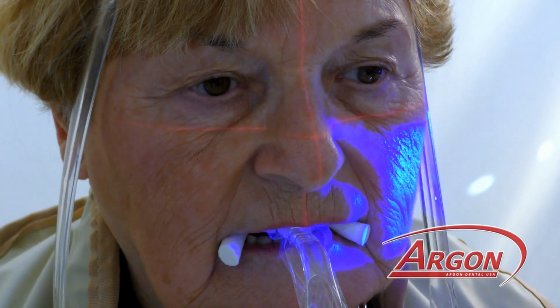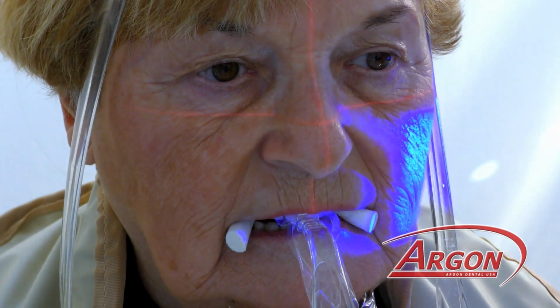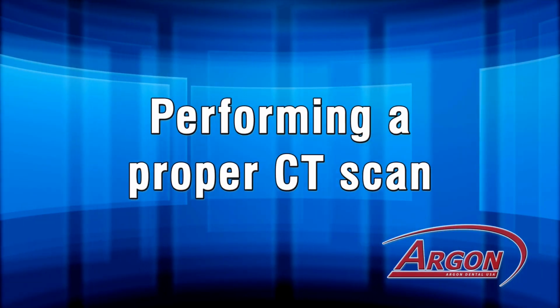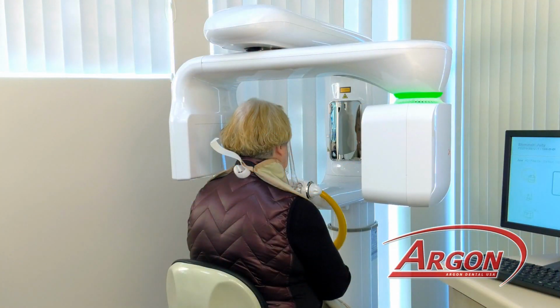As you can see, the blue light moving as we adjust the field of view. With the alpha 130, again, we will maximize to 13x10, and we will perform the CT scan with the patient wearing the denture.